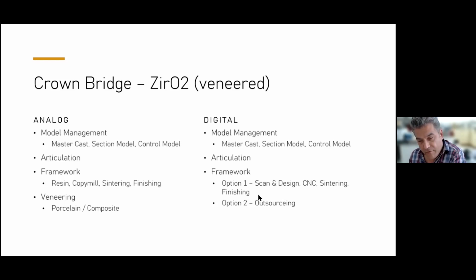Of course, you have to pay someone for that, but like I said before, you don't have to worry about it. It's like with dentures, for example, you also buy your acrylic teeth somewhere. You don't manufacture them by yourself. So you don't have to worry about the quality or anything. You buy it where you want to, where the price is maybe to your satisfaction. And of course, after you renew it again.